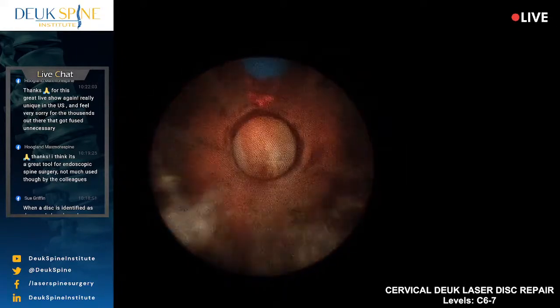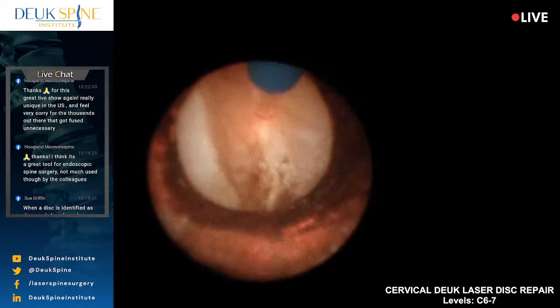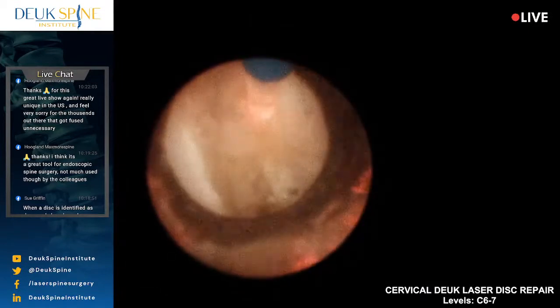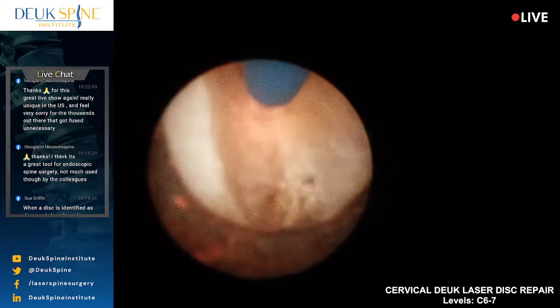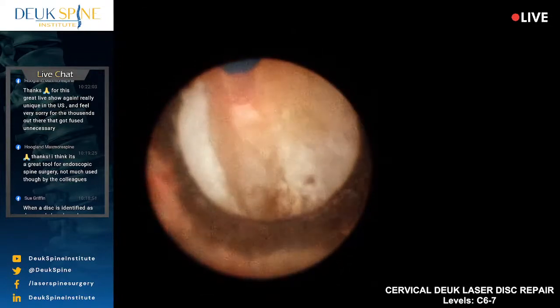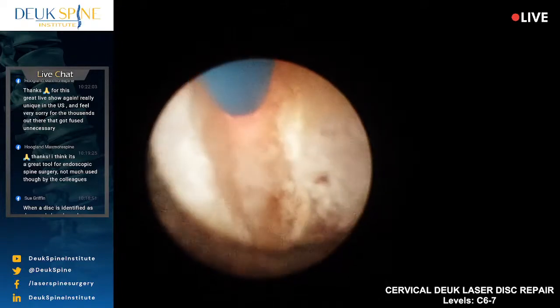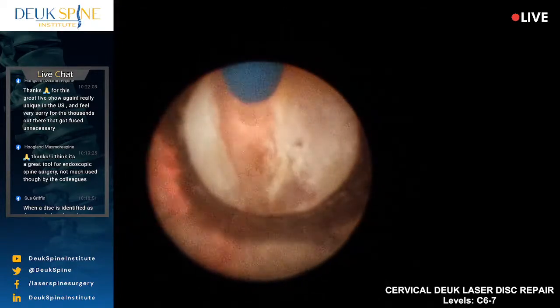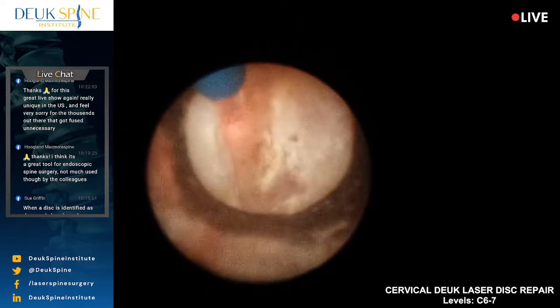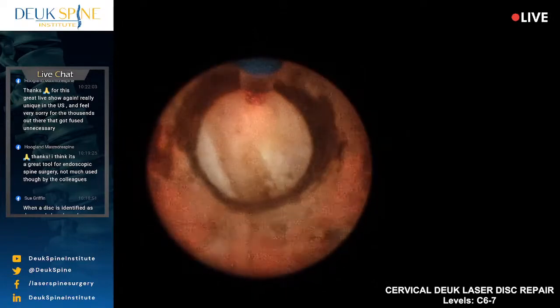I'm going to try to focus this a little bit better. Watch the fiber on my face. A lot of scar tissue right here. A lot of scar tissue. That's what I was working on earlier. That's all scarred up posterior ligament, posterior longitudinal ligament. And the more I can debulk it, the more I can get the pressure off that nerve.